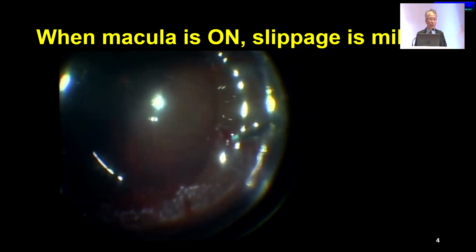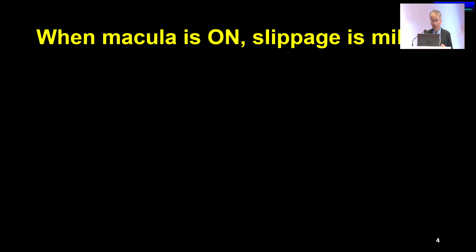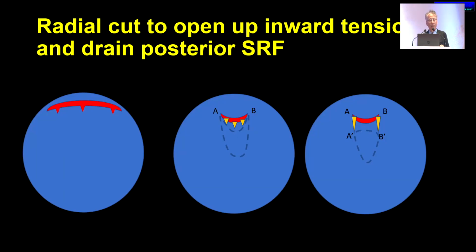And then when you try to do this fluid-air exchange, be careful that you put your extrusion tip from the posterior to the anterior, so that you can make the retina sit well. So why do we use a radial cut? For example, you can see that this radial cut can open up the inward tension and drain the posterior subretinal fluid. So you have A and B. If you cut deeper, then you have more chance to aspirate the trapped subretinal fluid.